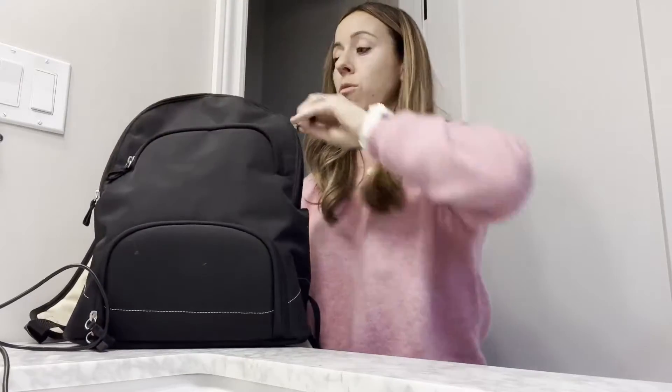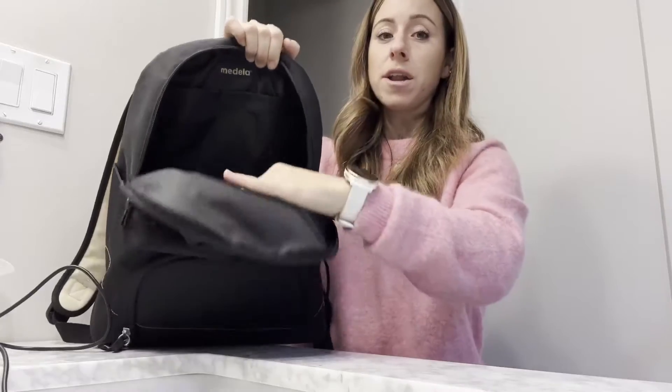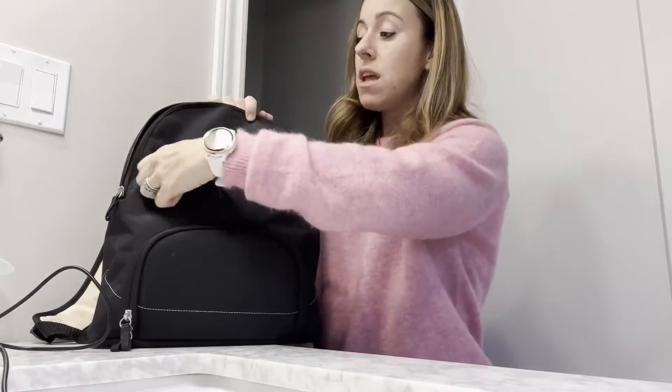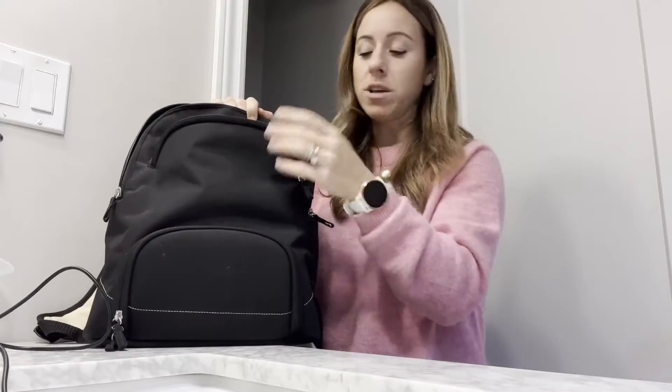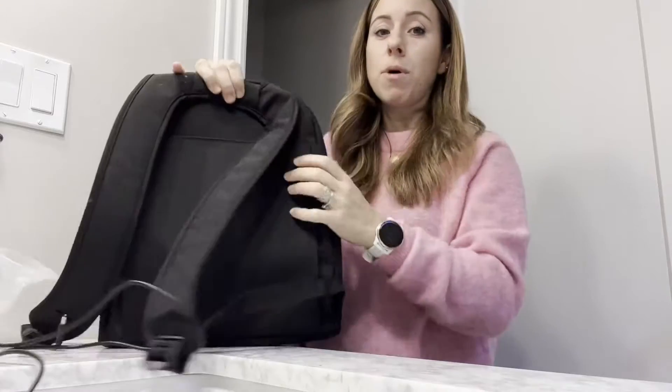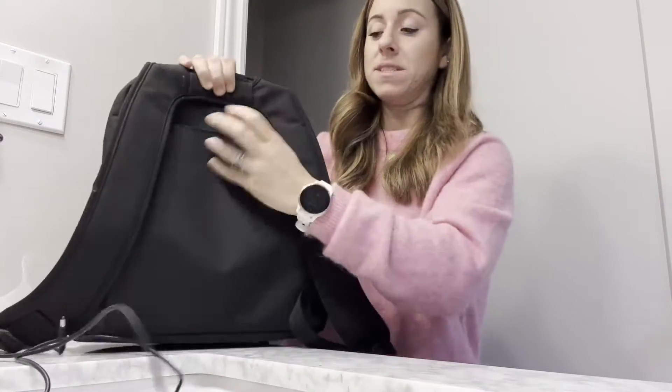Hey guys, Jenny here from WTI. Today I wanted to share this incredible breast pump backpack by Medela. I chose this specifically because it had a ton of storage, making it easy to have everything in one place. There's a huge storage spot here, another storage spot here that I used for my coat, keys, and wallet, and another velcroed spot in the back with a huge space.